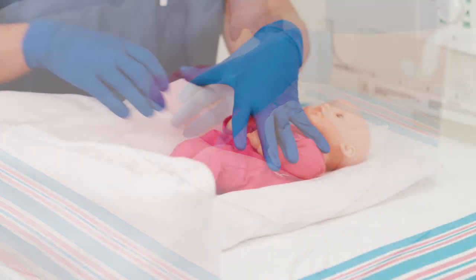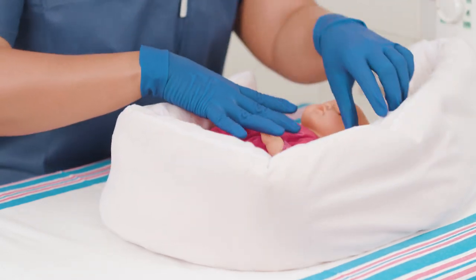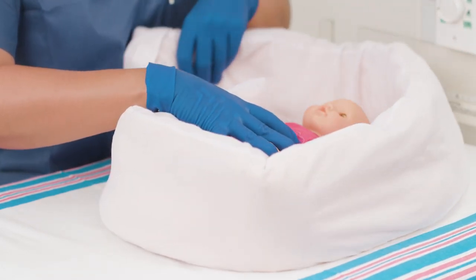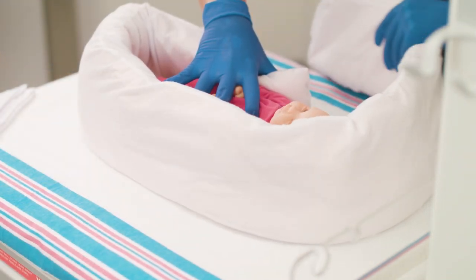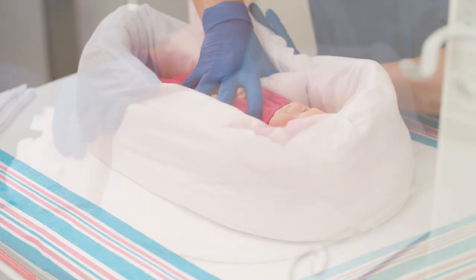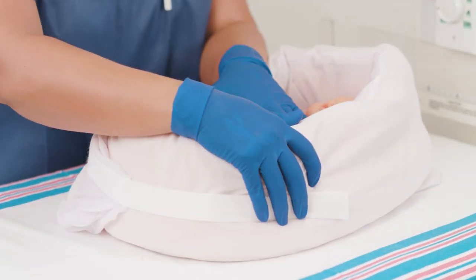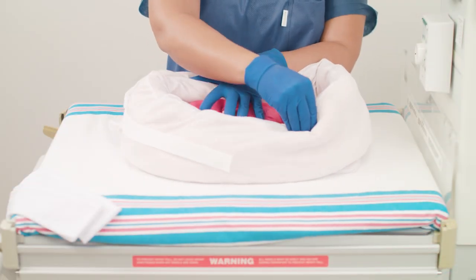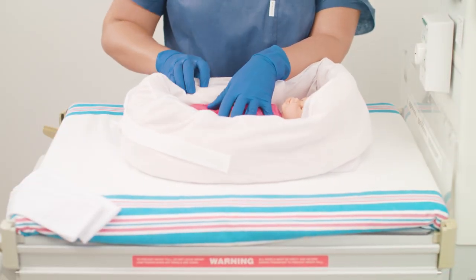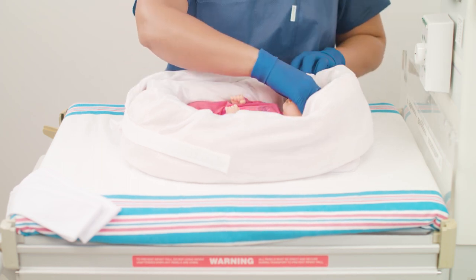Wrap the tube around the perimeter of the positioner, creating indentations as needed for medical equipment. Secure the tube with the attached strap. The tube positioner should conform closely to the body positioner. Mold the tube around the baby on all sides, ensuring the baby is in a flexed, contained midline position with the hips and knees flexed.